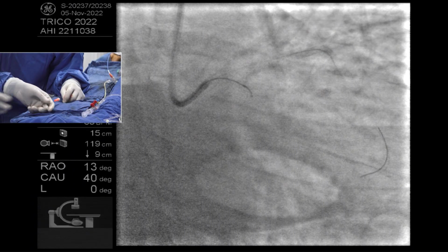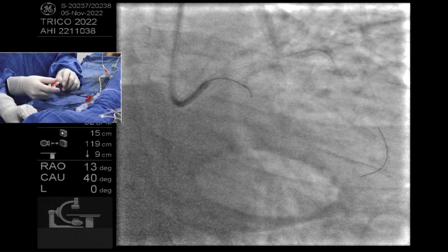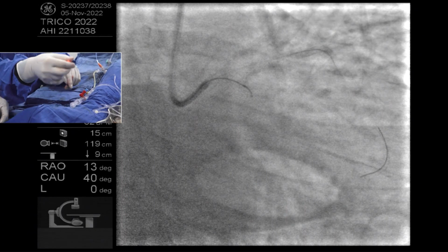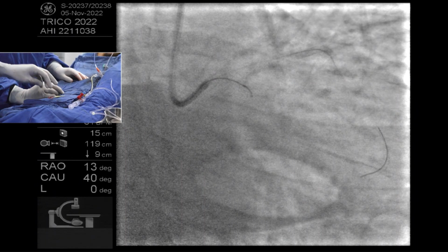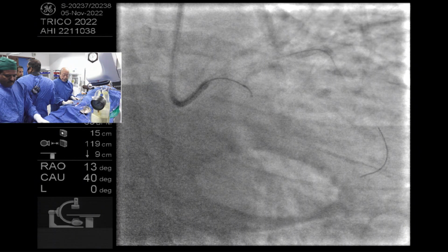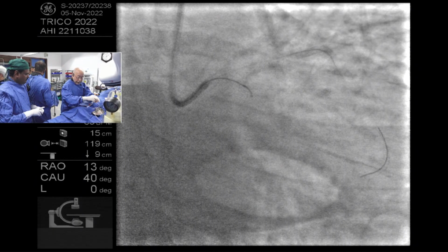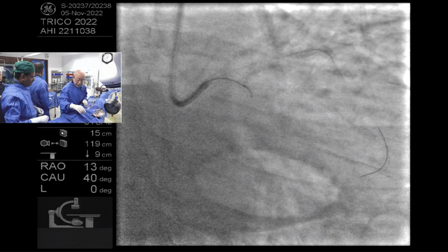Gaia First. What? I'm sorry, we couldn't hear you. Well, there is a catheter that has a side hole. Yes, it's called the dual lumen catheter. The Twin Pass, yeah. Twin Pass would help, because it brings you very close to that.